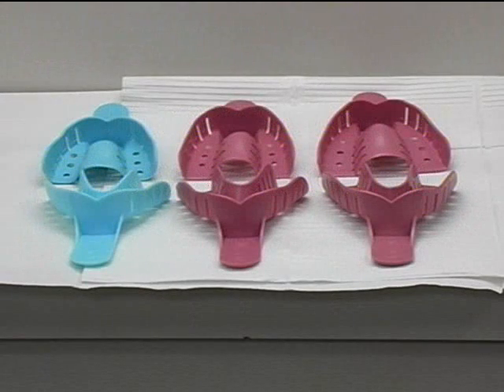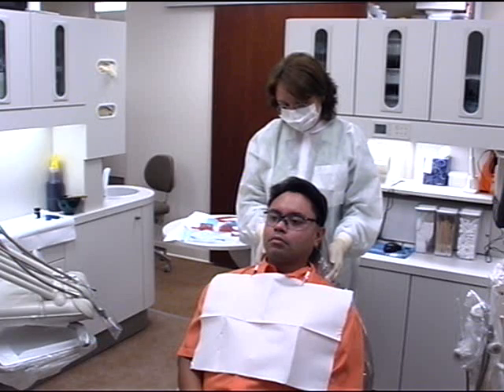Step 2. Impression tray selection. This demonstration will use disposable perforated plastic stock trays. Follow these steps to select the appropriate size of maxillary tray. Stand behind the patient.